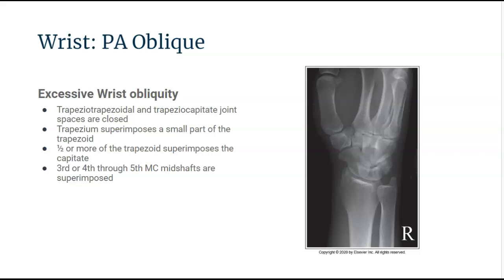In excessive wrist obliquity, we will see that the trapezio-trapezoidal and the trapeziocapitate joint spaces are closed. The trapezium and the trapezoid are overlapping, as well as the capitate and the trapezoid. The trapezium will superimpose a small part of the trapezoid. Half or more of the trapezoid superimposes the capitate, and the third or fourth through fifth metacarpal midshafts are superimposed, demonstrating that the wrist is in excessive obliquity.